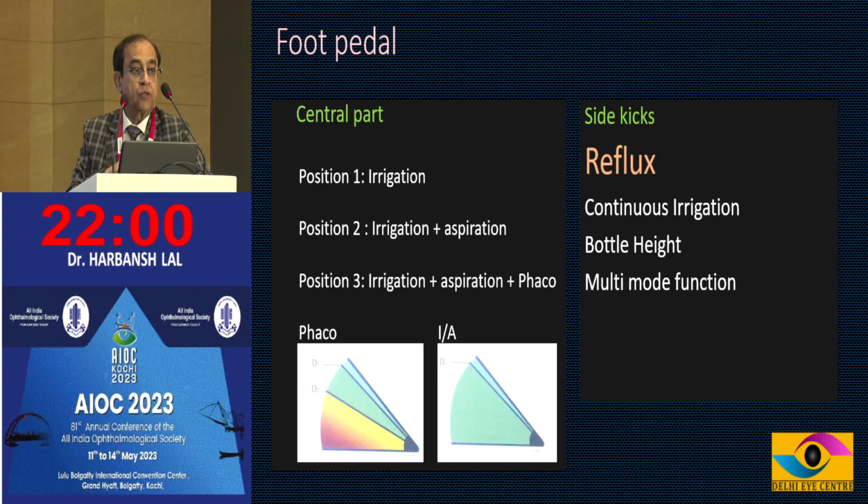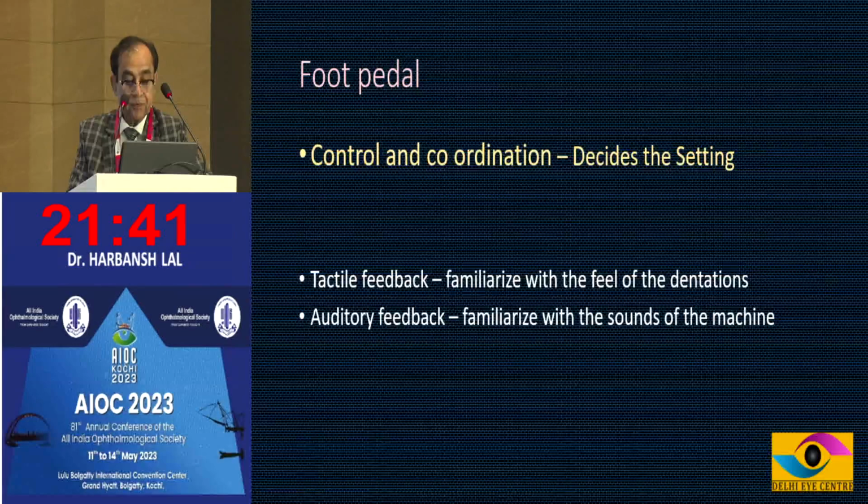And you need to know the side kicks which are very important, like a continuous irrigation mode, bottle height. I mean, there are multimodal functions where you can go from Phaco 1 to Phaco 2. So all these things you should familiarize beforehand and should have a full mental picture of all those buttons, even without using it on a patient.